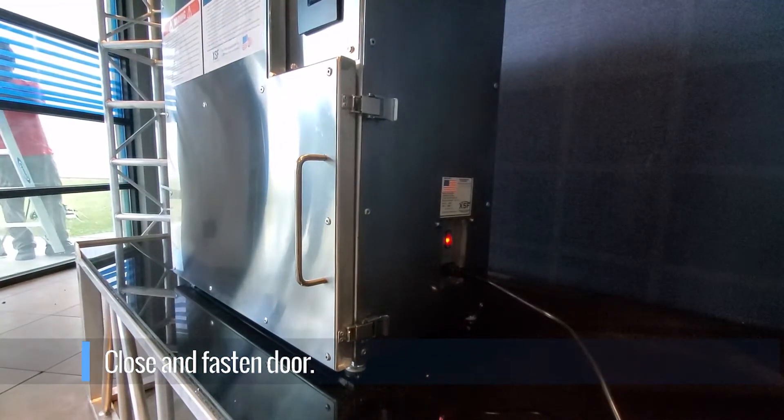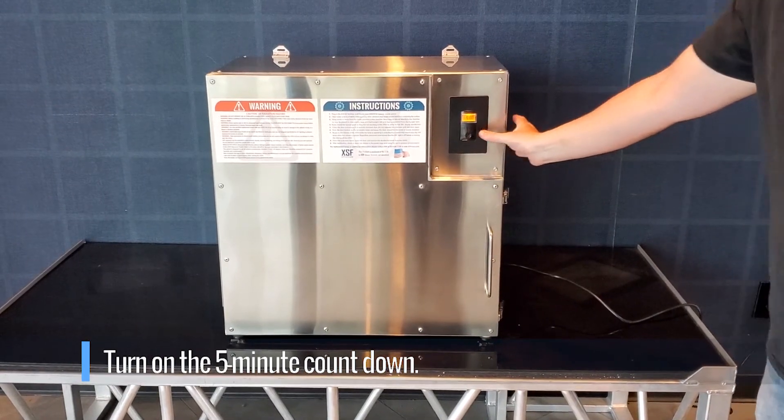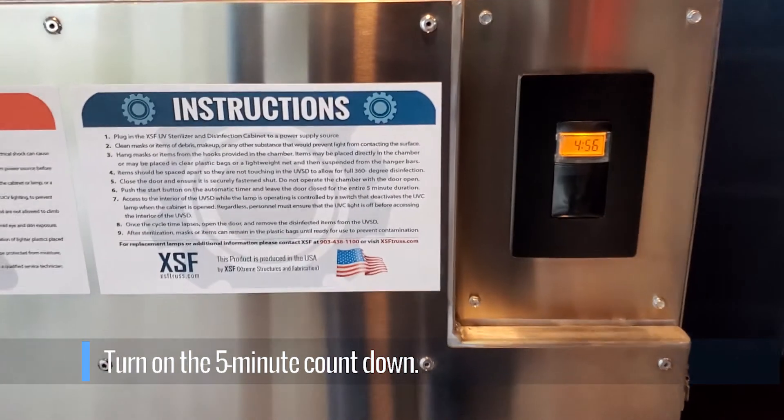The cabinet will not function with the door open. Pressing the button on the front of the cabinet will begin the 5-minute countdown timer and the disinfecting of your items.